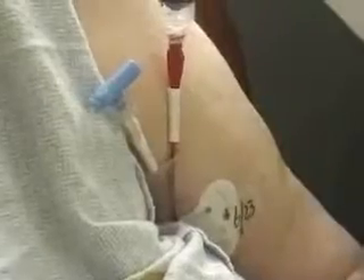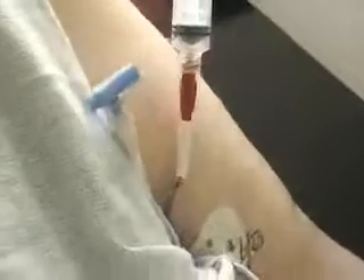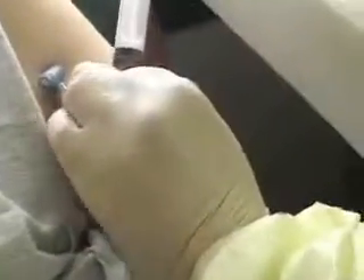We haven't drawn from hers before, so I don't know if it's even going to give me blood. Can you put your hand a little straighter here? It's a new PICC line, put in yesterday. I don't know if it doesn't want to give me blood — it doesn't want to give me blood, especially when you're filming.